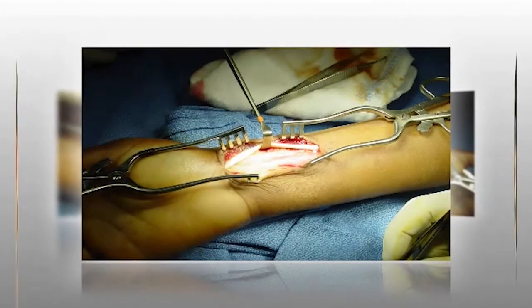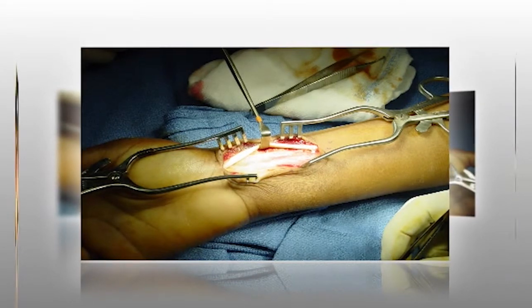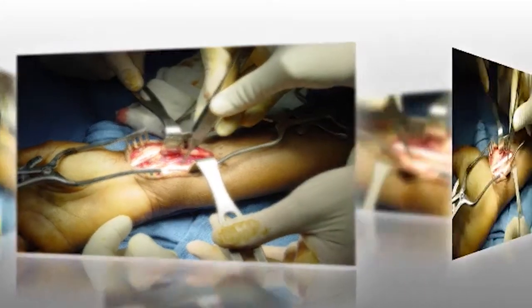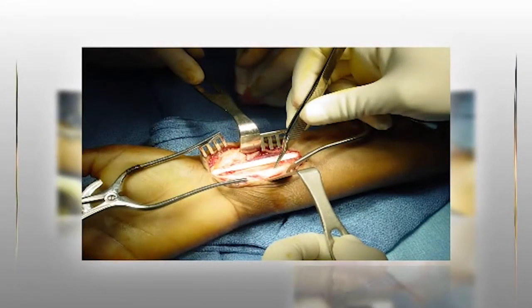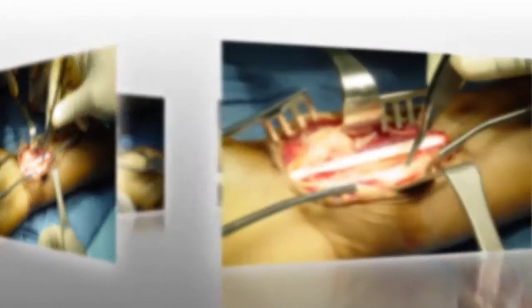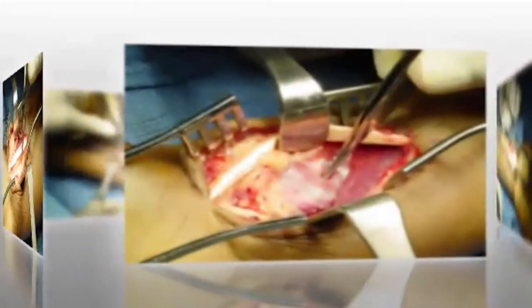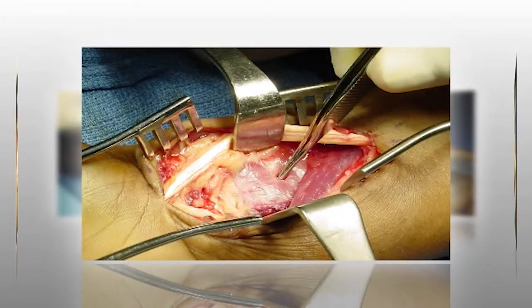The tendon sheath is opened and the tendon is retracted radially to protect the radial artery. The flexor pollicis longus is identified by passive flexion and extension of the thumb interphalangeal joint and is retracted ulnarly to protect the median nerve. Next, the pronator quadratus is identified by its transverse fibers and is released radial to ulnar to expose the fracture site.